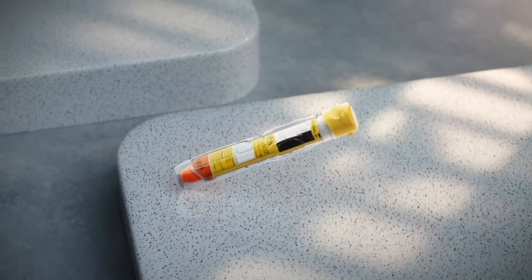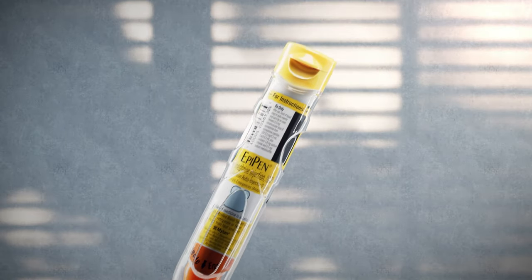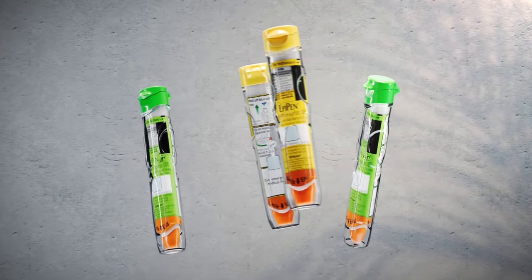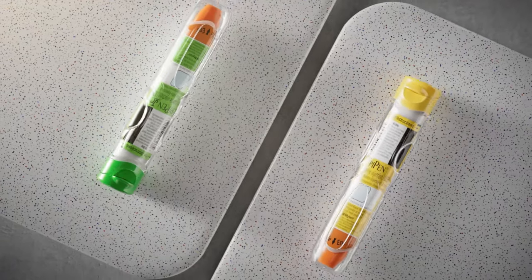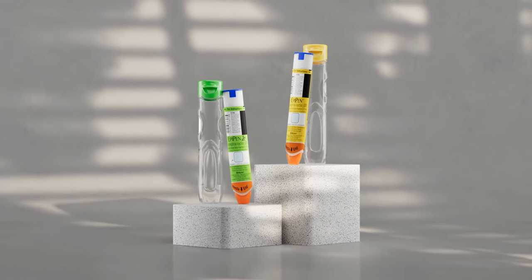The single-dose EpiPen or EpiPen Jr. auto-injector is for allergic emergency anaphylaxis and should be used right away. You can use a second EpiPen or EpiPen Jr. auto-injector if symptoms continue or if symptoms come back.